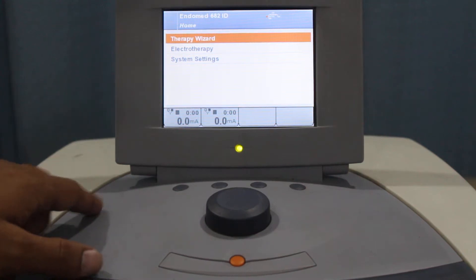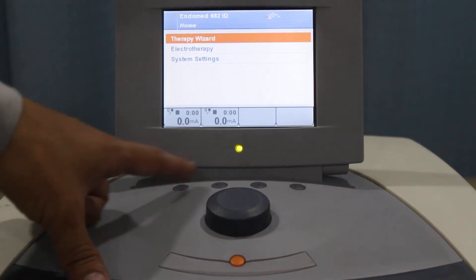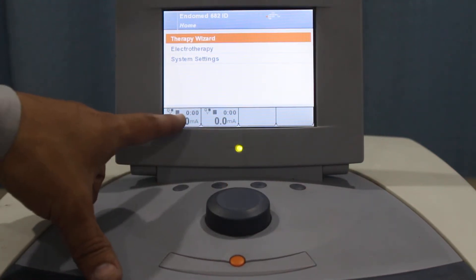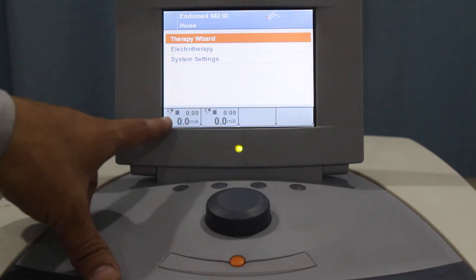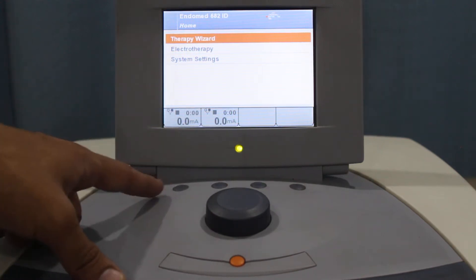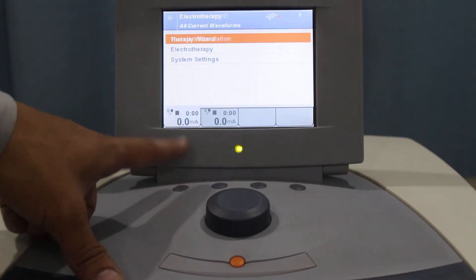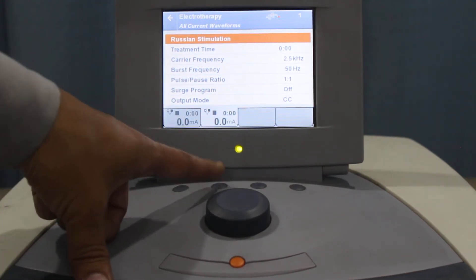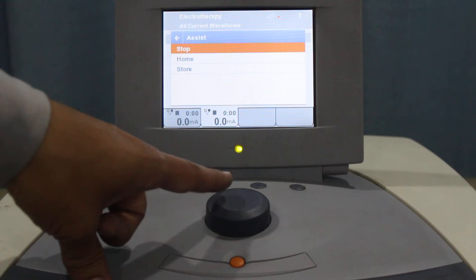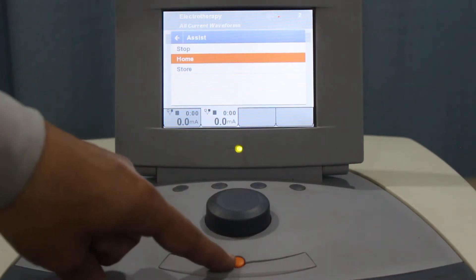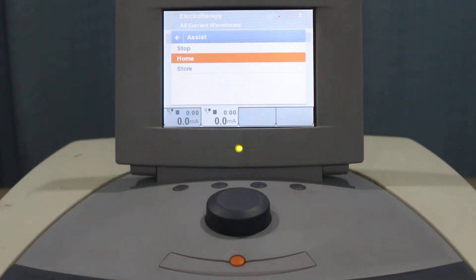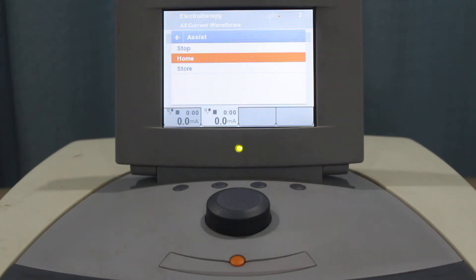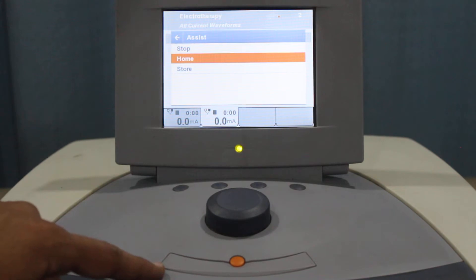Let's discuss the controls. These two keys represent the output intensity and you can directly control the channels with the help of these keys. As you can see, if I press this it shows channel one, and same for the other one. This orange key is to help you select the home, stop, or store option, and this bottom key is for the selection.